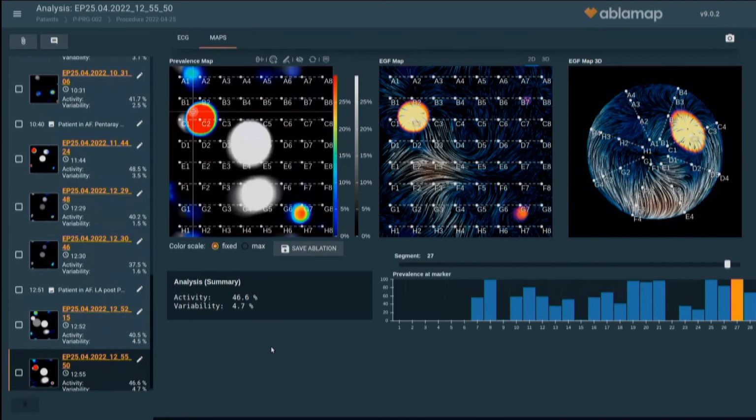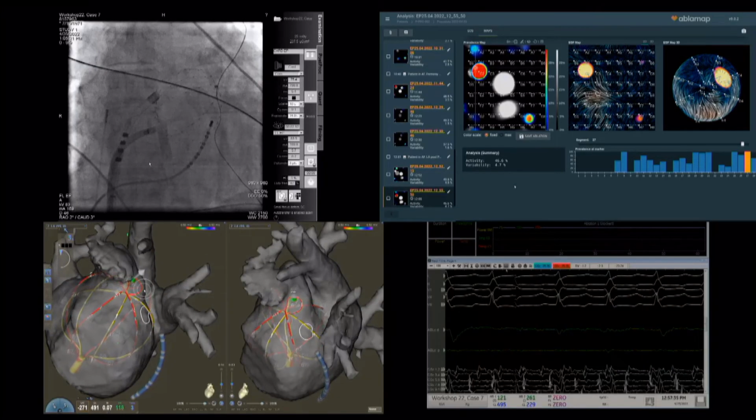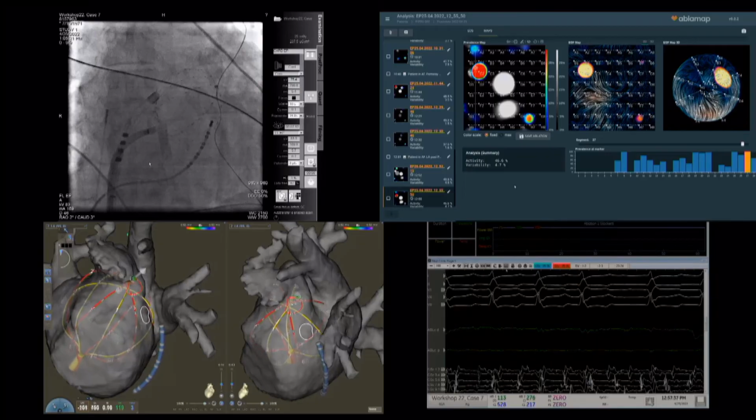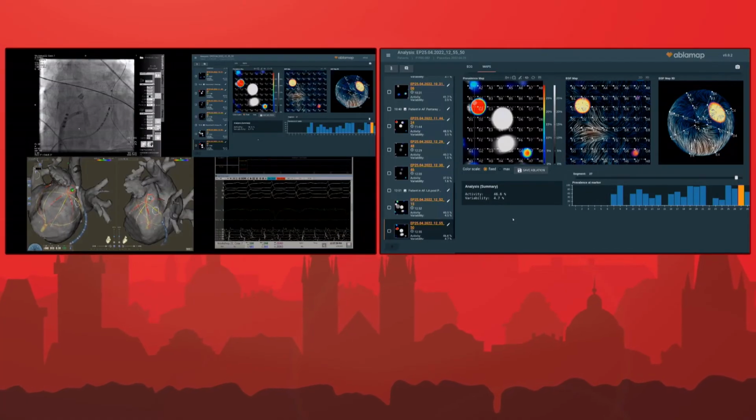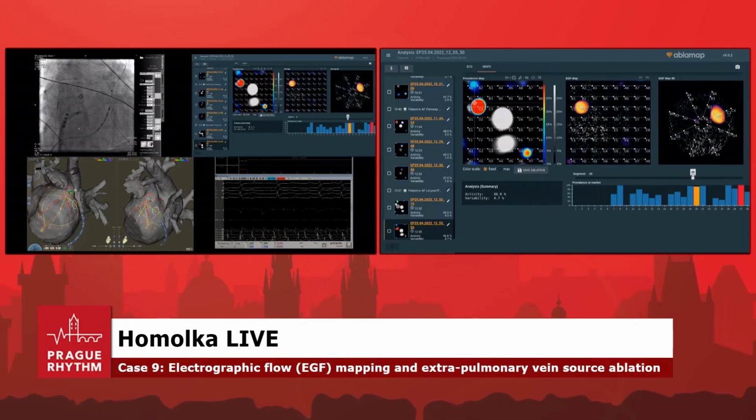Is this an RF ablation catheter? Yes. Do we want RF? Yeah, we should do RF. We can do RF on mapping. I was thinking maybe we do PF. No, do RF. Let's do it the right way. Okay, ablation.